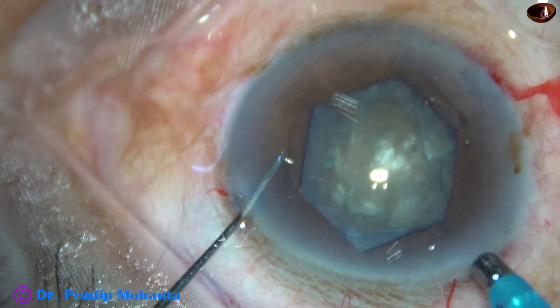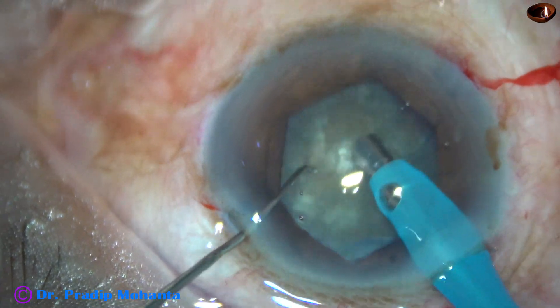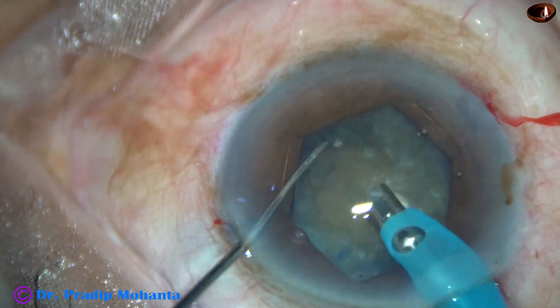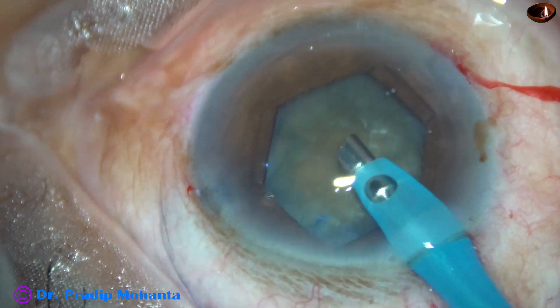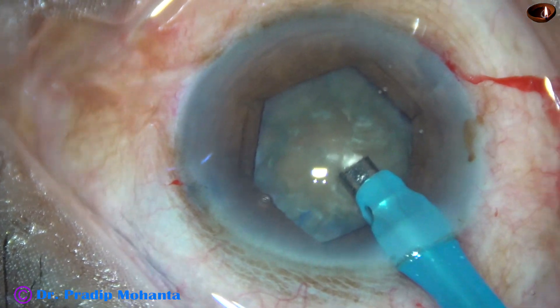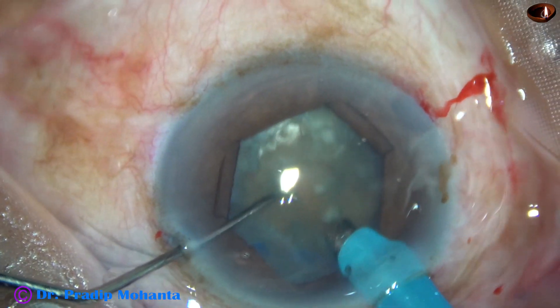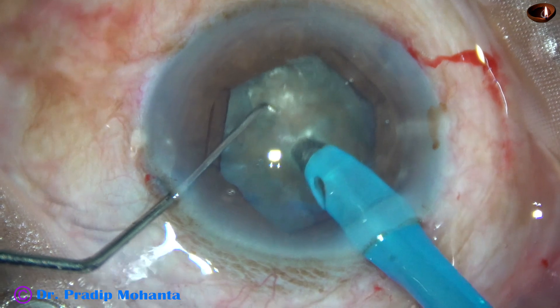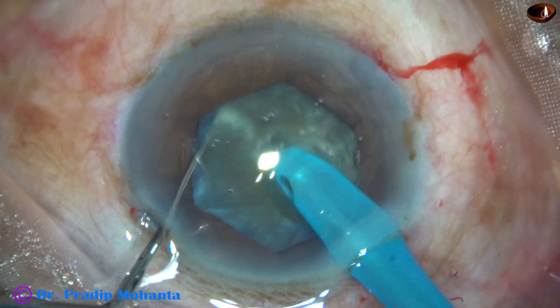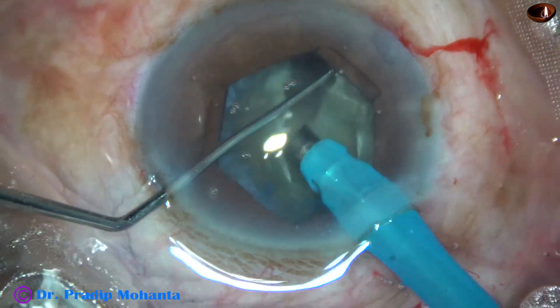The phaco needle goes in with its bevel down. Some superficial cortical lens matter is removed, then the handpiece is turned to make the bevel up. The nucleus is pushed a little down. The tip is buried into the substance of the nucleus, it goes towards the opposite equator, and a deep, nice crack is done.